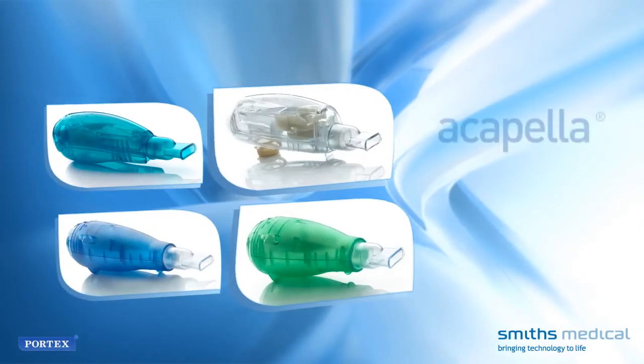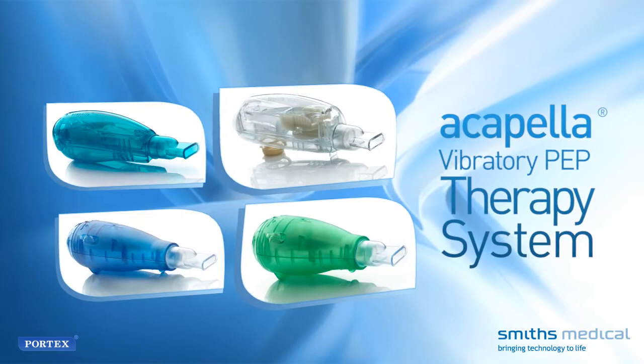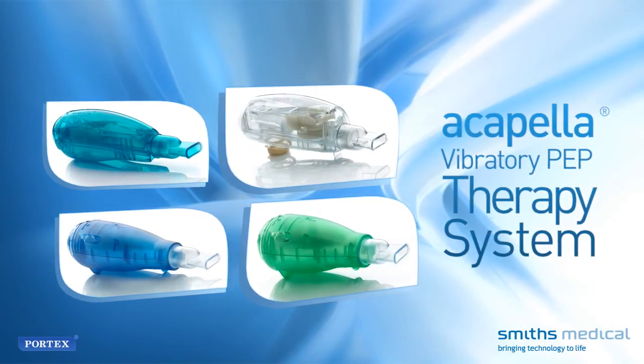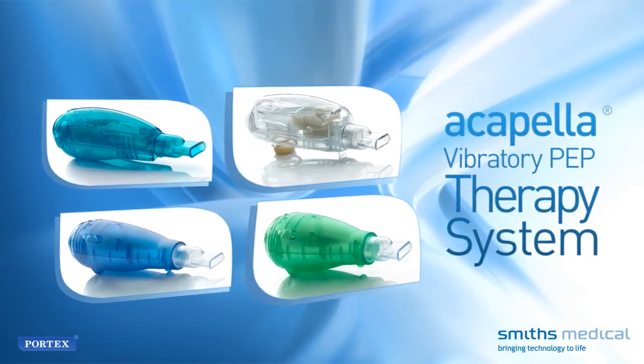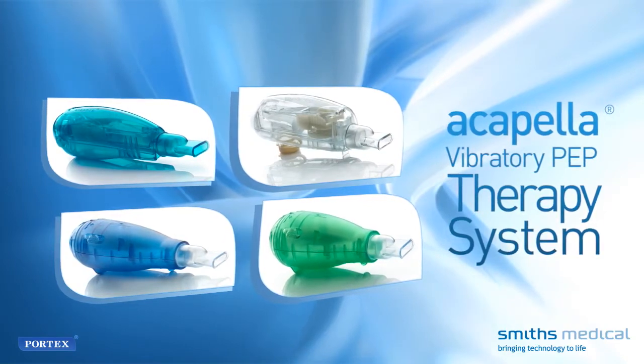It's important to keep the Acapella vibratory PEP therapy system clean and germ-free. It's also important to inspect the device for damage before each use. If at any time you feel that the Acapella is damaged or not working properly, do not use it. Contact your healthcare provider for advice.